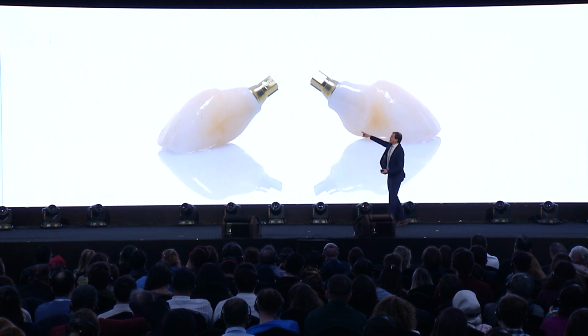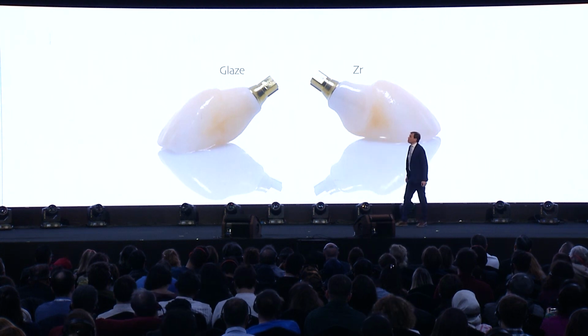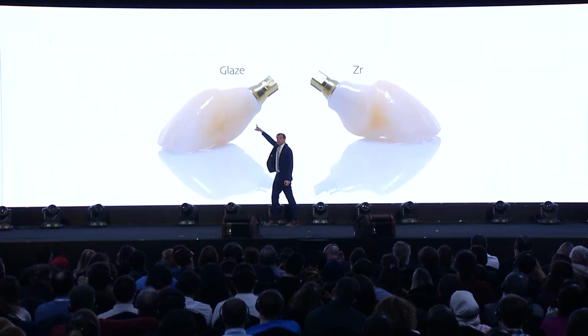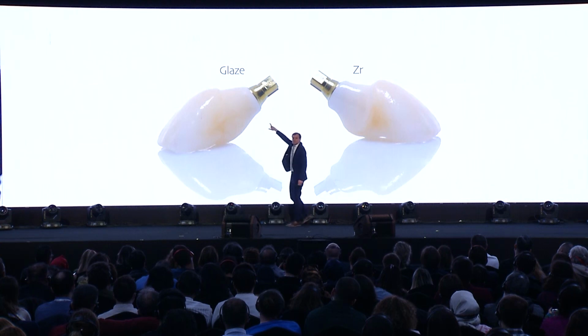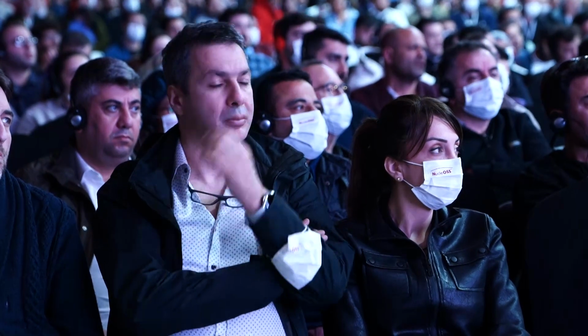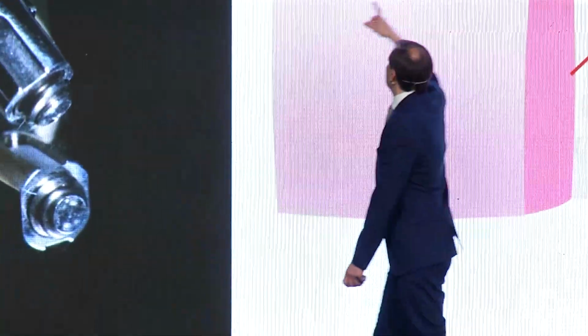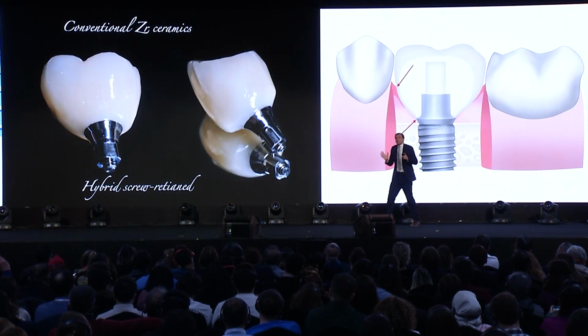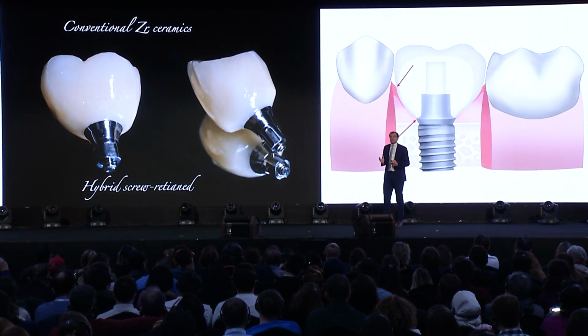And it comes again to the lab work that sometimes labs, I don't know about here, but in Lithuania in the past, they were glazing zirconia restorations. So they were designing the cases like that you are leaving zirconia inside and putting porcelain all around the restoration.